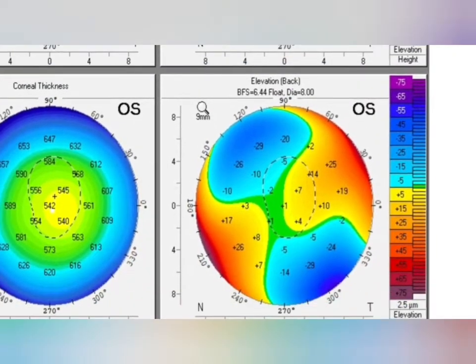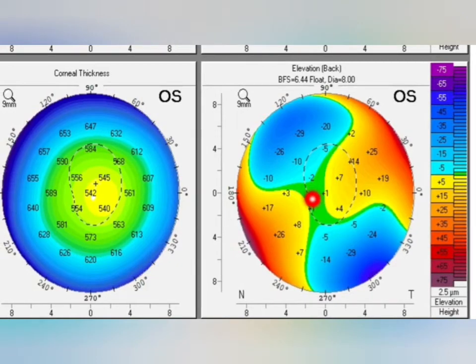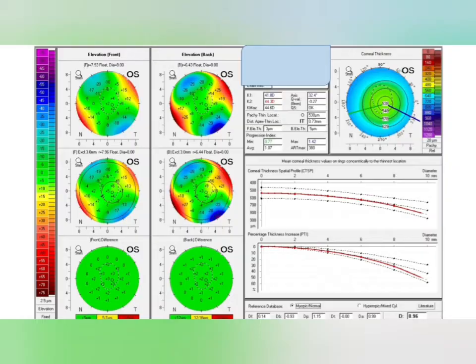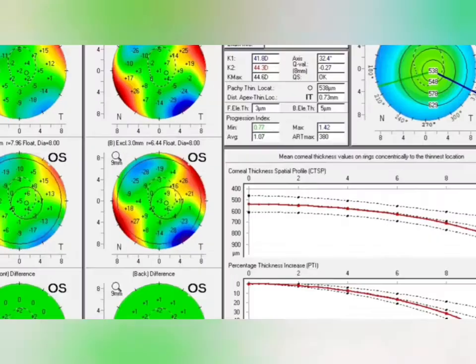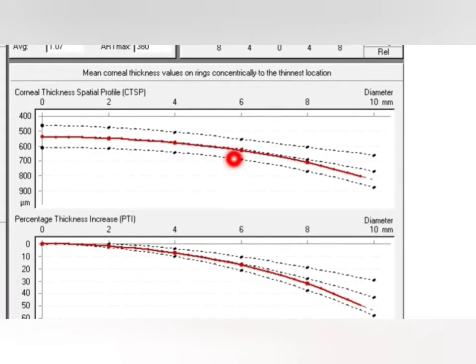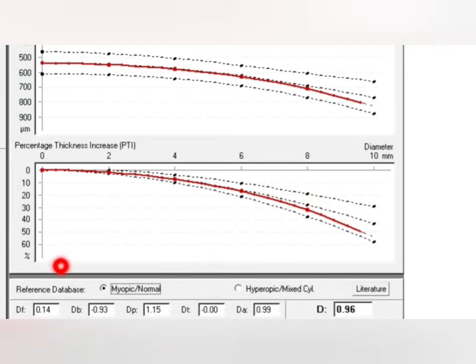In elevation front, the thinnest local corresponding point is plus 3 — less than plus 8, normal. In elevation back it is less than plus 7, and in the central 3mm area it is less than 20 — absolutely normal. The corneal thickness map shows the thinnest point at 542, which is more than 470, so normal. In the Belin-Ambrósio map, the average value is 1.07 — absolutely normal — and the red curve is continuous up to 6mm. The D mean value is less than 1.2, also absolutely normal.